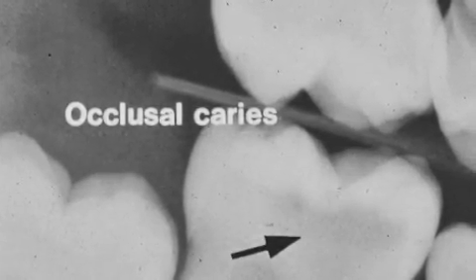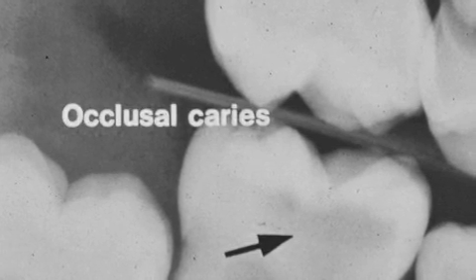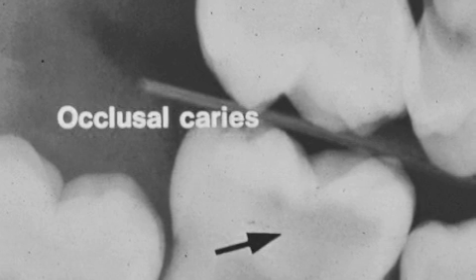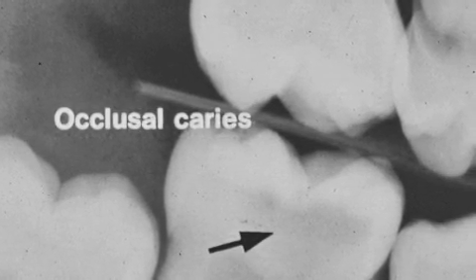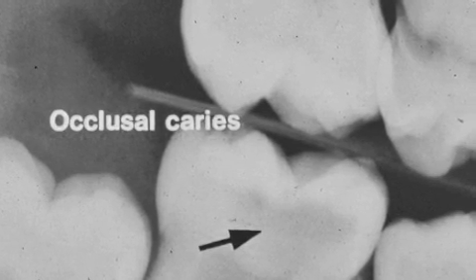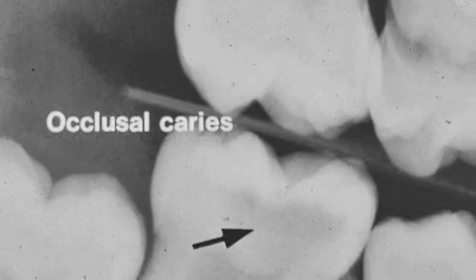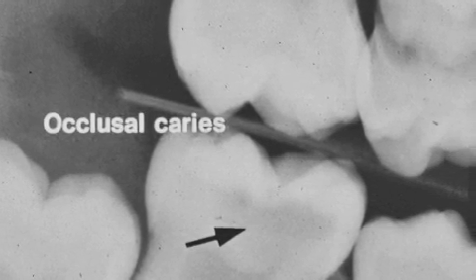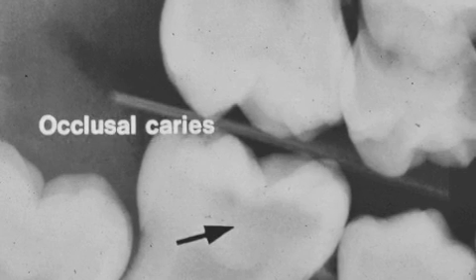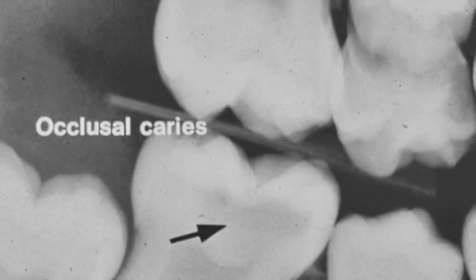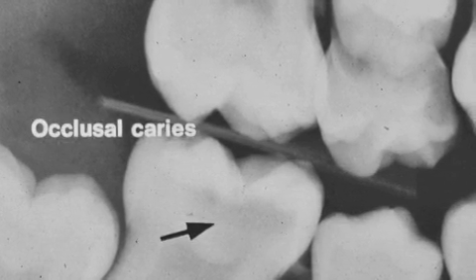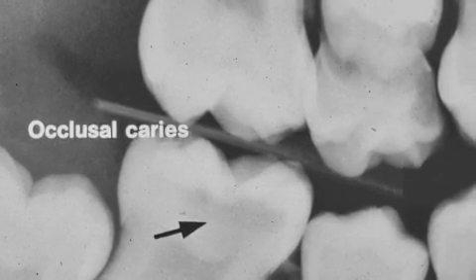Tooth number 30 has occlusal caries seen as a radiolucency along the dentinoenamel junction. Notice that the enamel is intact. Therefore x-rays are crucial for observing and finding occlusal caries. Is this a C1, 2, 3, or 4 radiographic caries classification?